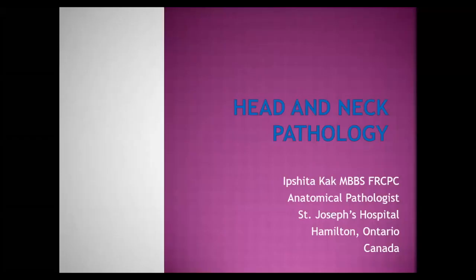Today we have Dr. Ipshita with us, who is a consultant pathologist at St. Joseph's Hospital in Hamilton, Ontario in Canada. She's going to talk about head and neck pathology with special emphasis on special stains and ancillary techniques used in this region.